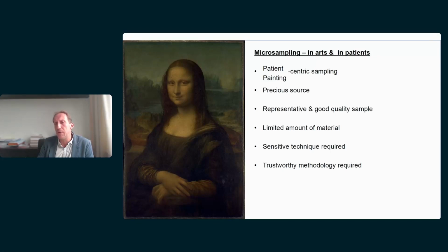Because these results may determine whether a patient may get a different treatment. And unfortunately, what we know is that many methods have not been firmly shown that they are truly robust to be really applied in real patient practice. So there's still work to be done.